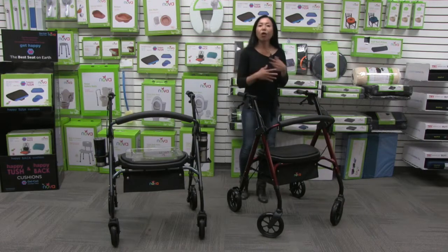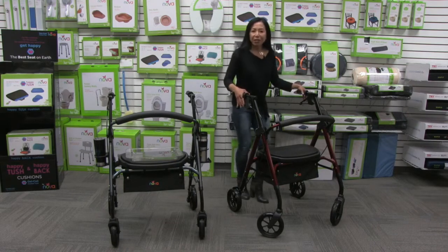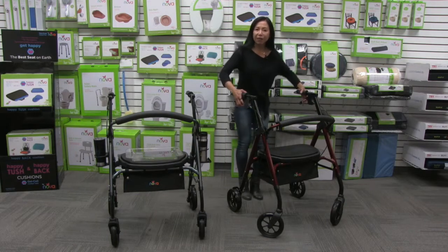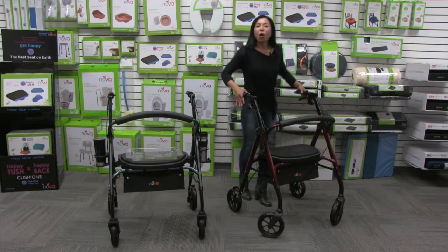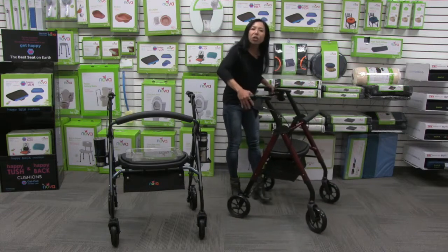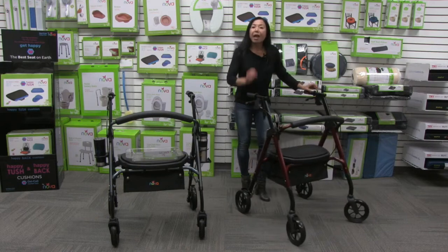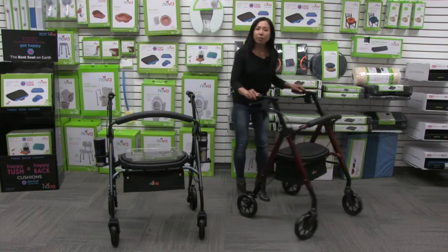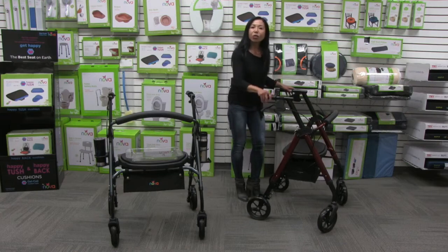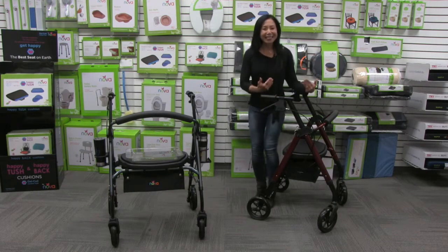All the Stars, including this one, come with our Feather Touch easy-to-use handbrake system. It's so important to have brakes that are easy to use but also very effective. To control the speed, all you have to do is pull up on the handles — it only takes a little bit of effort. To lock the brakes in a parked position, just push down on the handle and now the brakes are in a parked and locked position — and it's in this position that you can take a seat.